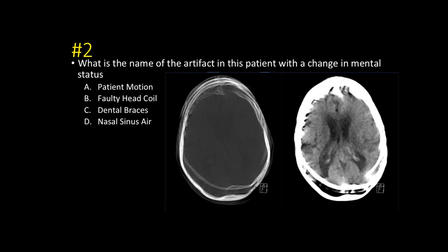Question number two: what is the name of this artifact in the patient with the change in mental status? It's another easy one — this is patient motion artifact. The CAT scan is blurred and ghosted because the patient was moving around a lot. Another bread-and-butter easy case.